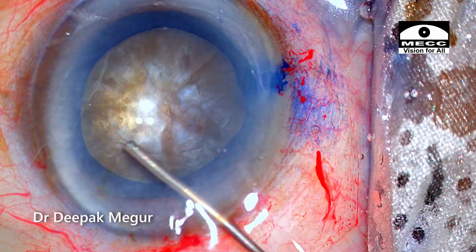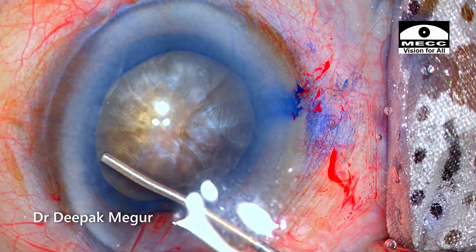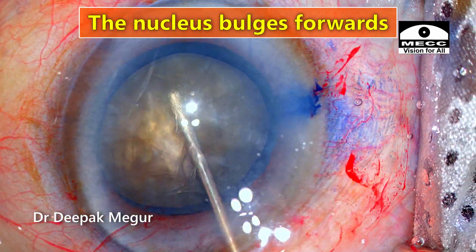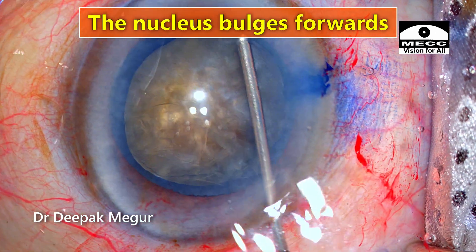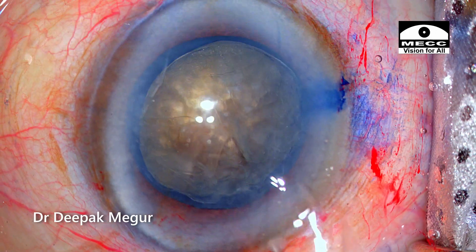Hydrodissection needs to be very gentle since I am dealing with a large nucleus. Just a little bit of fluid — I can see the nucleus pop up slightly and that should be fine. You need to carefully observe these subtle signs. The nucleus just bulges out anteriorly just a bit.